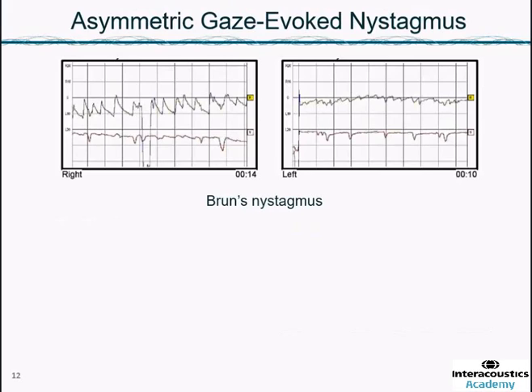This nystagmus is generated by a large acoustic neuroma. And just think for a second and decide with yourself which side is the acoustic neuroma. Since you have a 50-50 chance of getting it correctly, I'll just go ahead and explain which one it is.